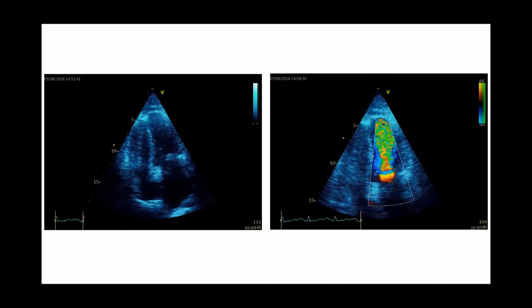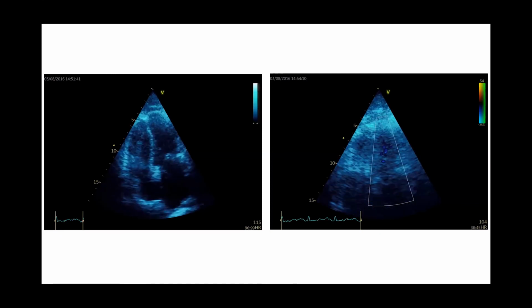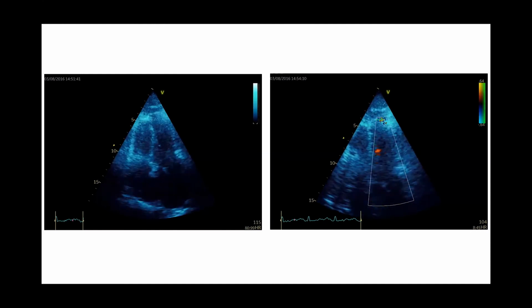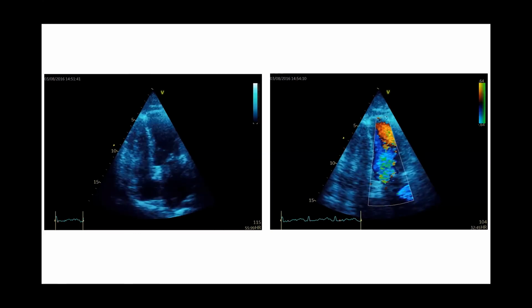The annulus perhaps of the mitral valve appears calcified or at least partially fibrosed. I'm struggling to see the tips and leaflets on that view though, so I'd like to pan through and try and get a better view of the actual cusps and or the leaflets and tips.